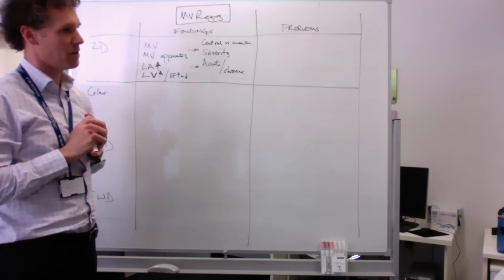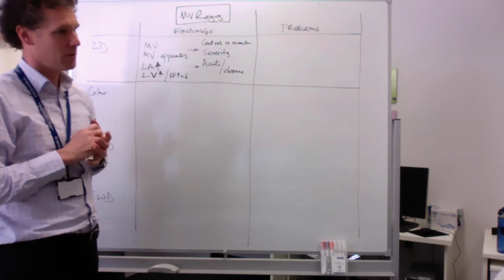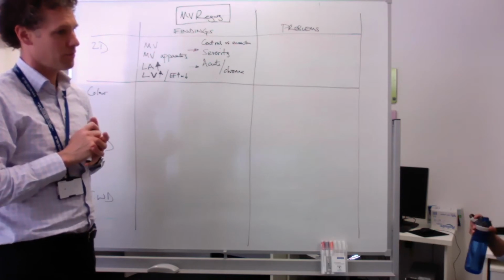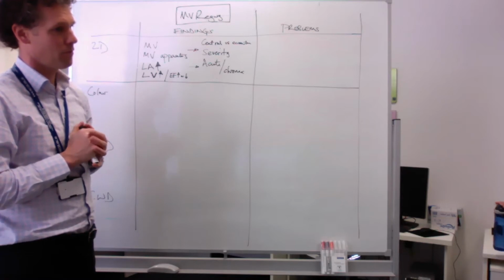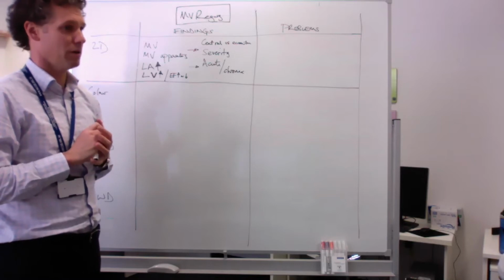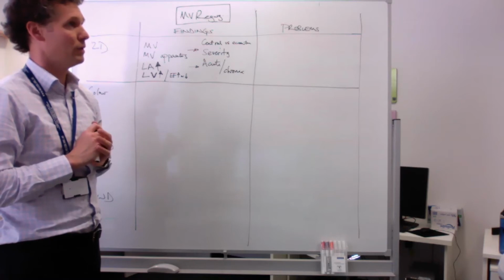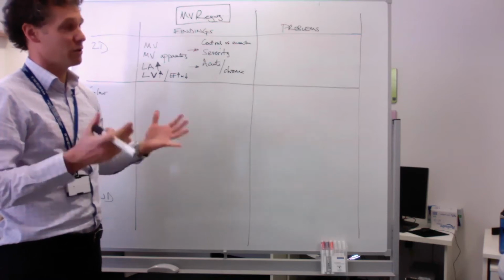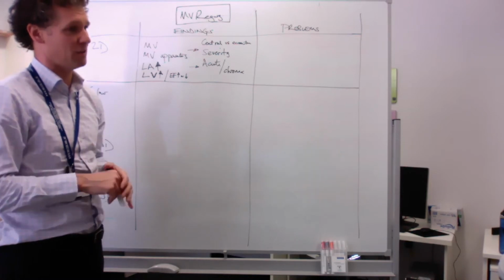Do you mean primary as in caused by the mitral valve, and secondary via dilatation? Yeah. So if it looked normal, plus you had annulus dilatation and a poor left ventricle, then that would imply it was secondary. Yeah, absolutely. And I think there are multiple things that can cause your LV to be down. I think you can say that the MR will be contributing to that in some way.